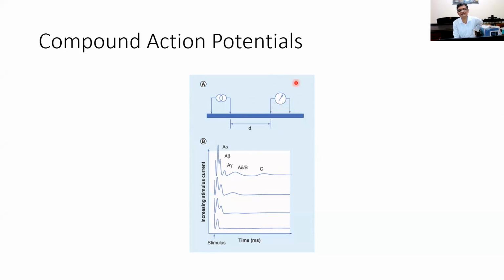In this diagram, this is kept on the nerve itself, but further down you can keep it on the muscle, and you will get similar behavior, right? So that is the basis of electroneurogram. You give a current to a nerve and you record on the corresponding muscle supplied by the nerve using surface electrodes, right? Using needle electrodes also you can record muscle activity, the action potentials and things, but that is beyond the scope of this practical.